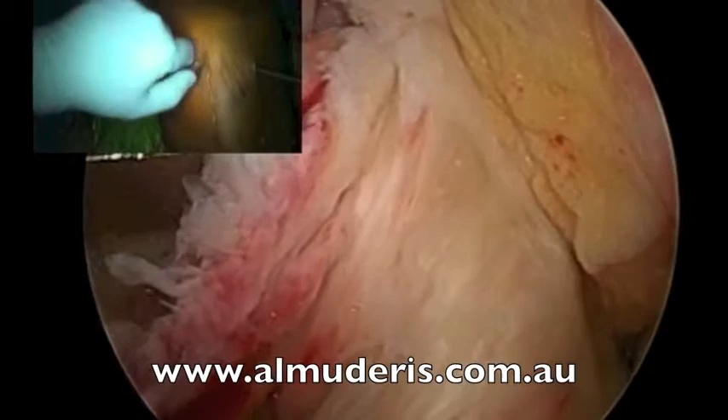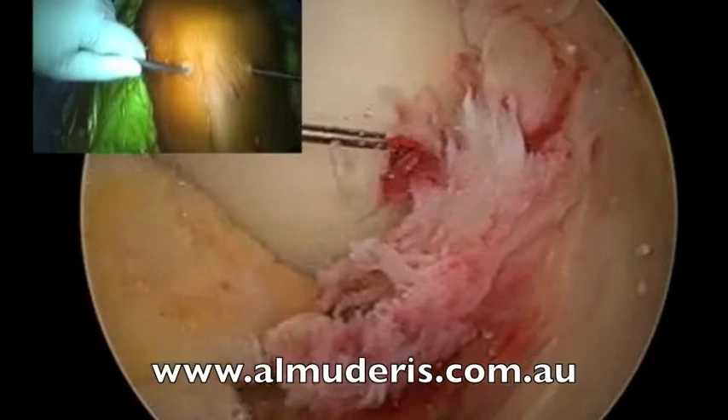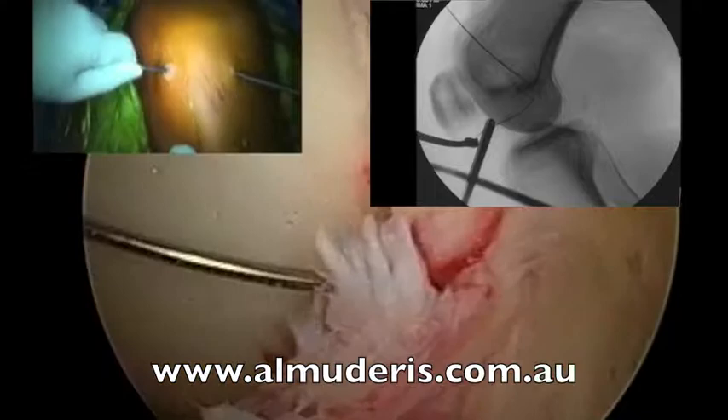The jig has a cannulated end, and we make sure that the wire passes through the jig. As you can see, I retrieve the jig with the wire through the lateral portal.